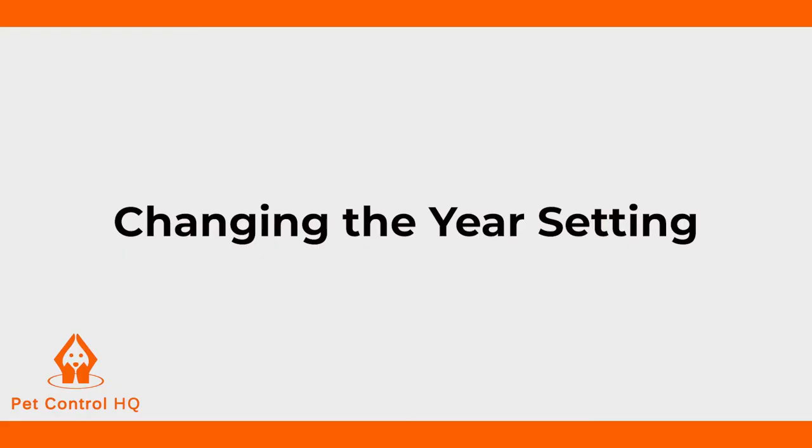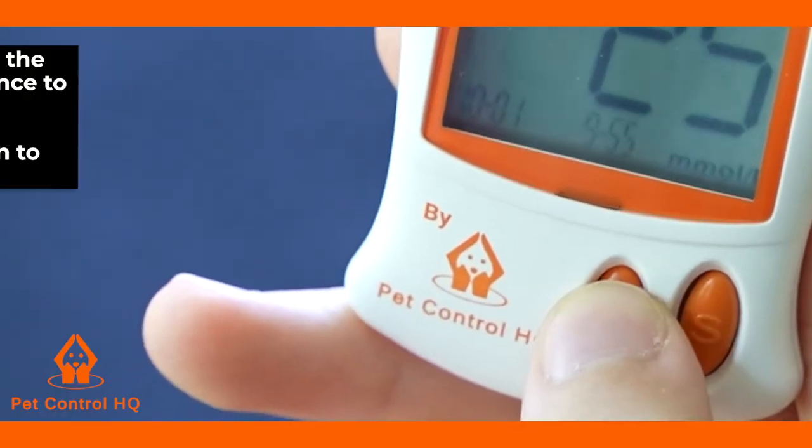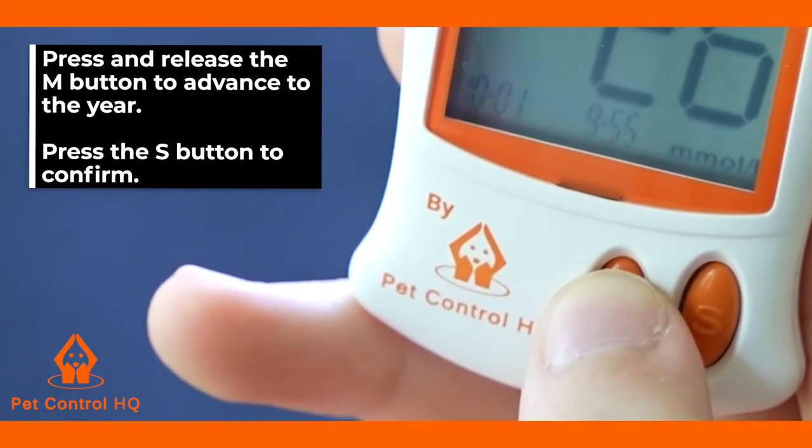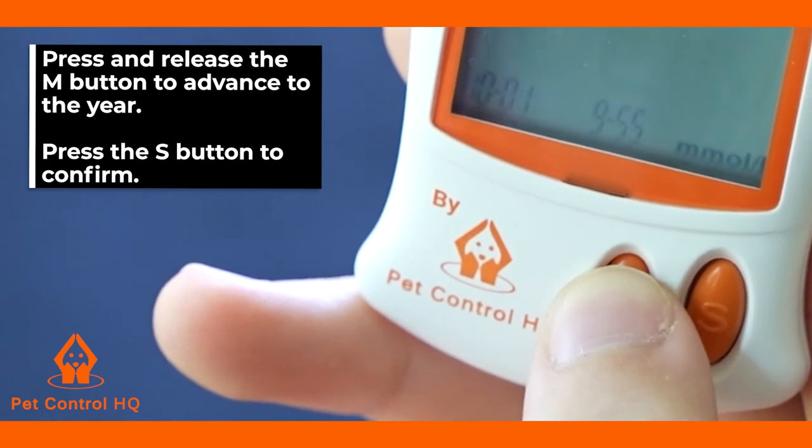The year setting will then be displayed on your monitor screen. To change the year setting, press and release the M button to advance to the year. When the correct year appears on the screen, press the S button to confirm.